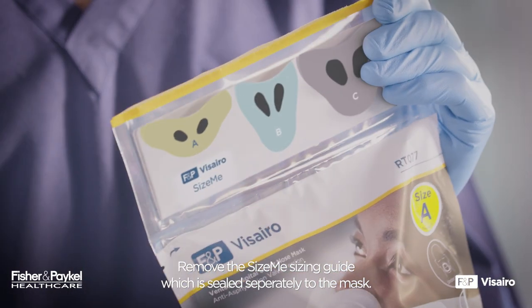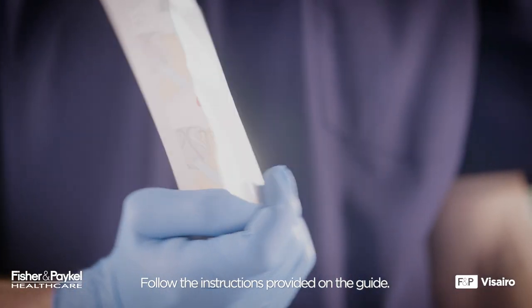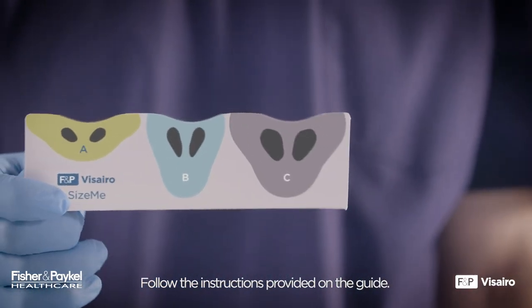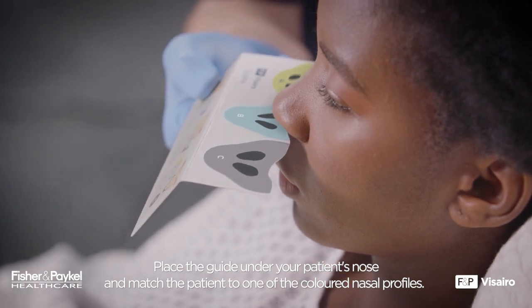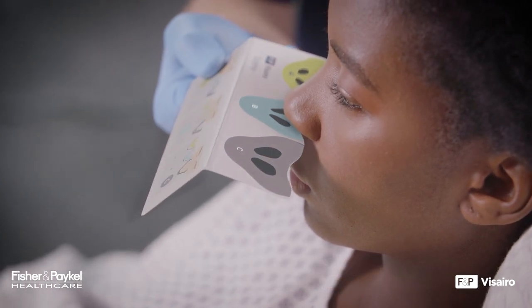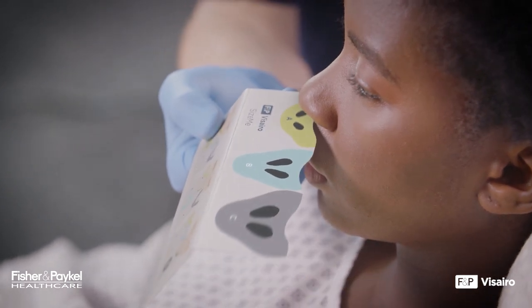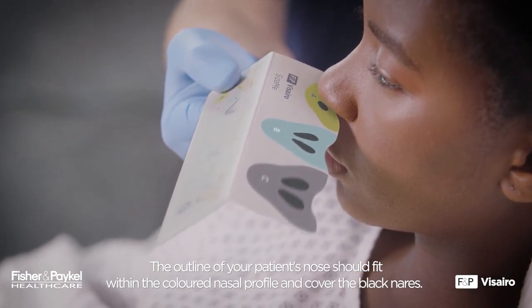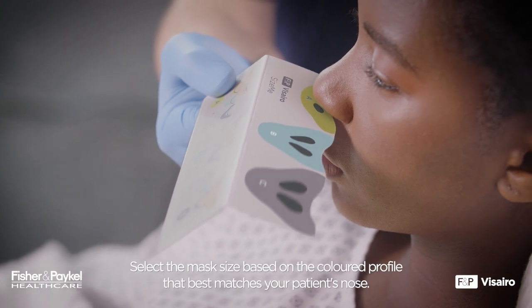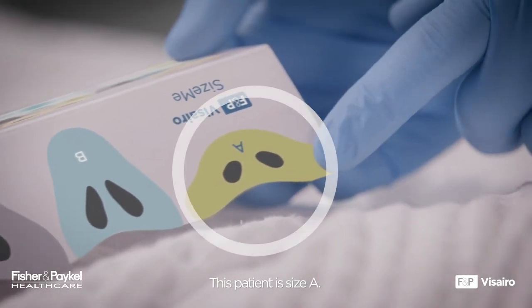Remove the Size Me sizing guide, which is sealed separately to the mask, and follow the instructions provided on the guide. Place the guide under your patient's nose and match the patient to one of the colored nasal profiles. Tilt the guide upward so that it lays flat against the patient's nostrils. The outline of your patient's nose should fit within the colored nasal profile and cover the black nares. Select the mask size based on the colored profile that best matches your patient's nose. This patient is size A.